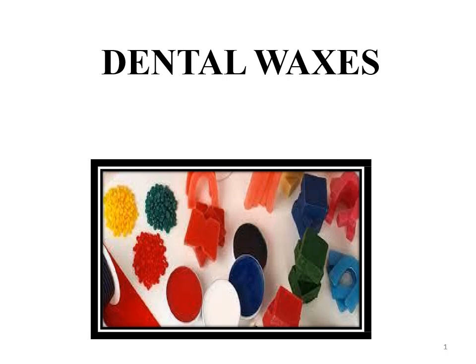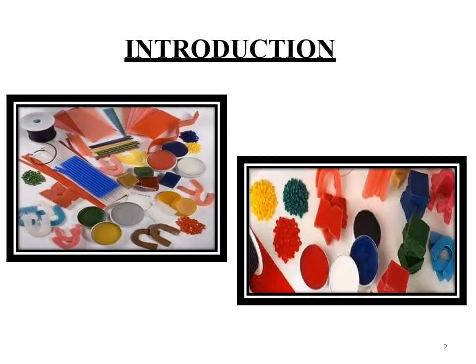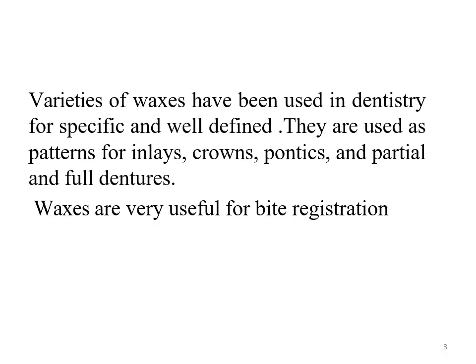The topic is dental waxes. Coming on to introduction. A variety of waxes have been used in dentistry for specific and well-defined purposes. They are used as patterns for inlays, crowns, pontics, and partial and full dentures. Waxes are very useful for bite registration purposes.